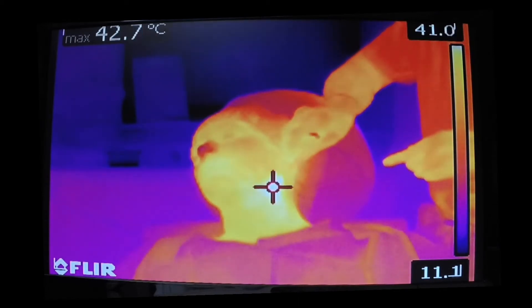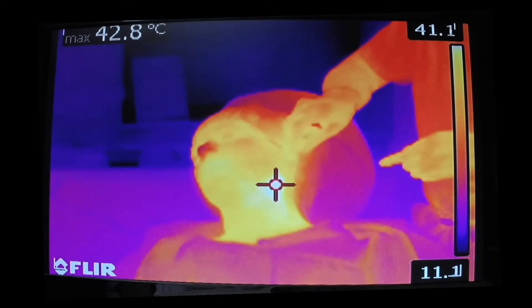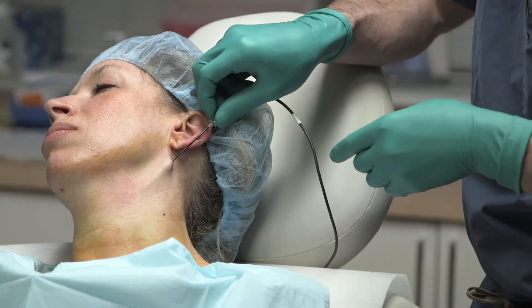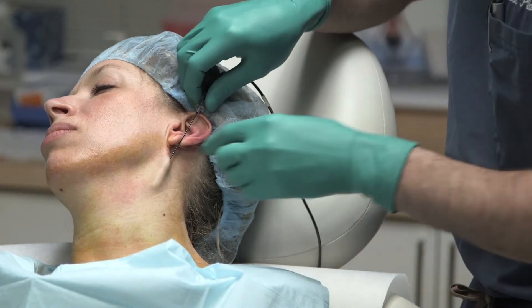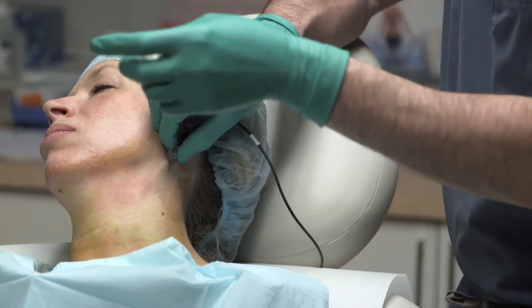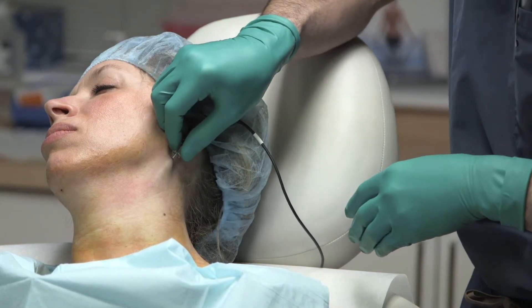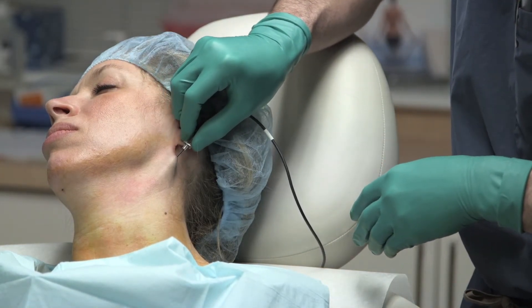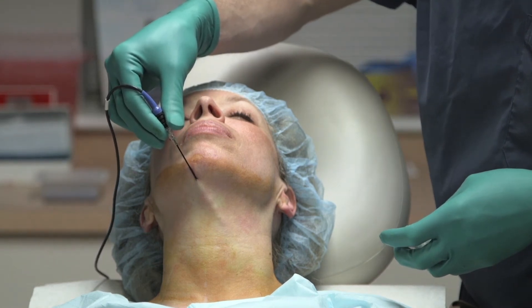On this side of the neck, you can see that the max temperature of the skin is now about 42.8 degrees Celsius. We're beginning to reach our end point, which is a temperature throughout the treated area of the neck of around 42 to 45 degrees Celsius of the skin. That corresponds to either a 65 or 70 degrees Celsius temperature deep.